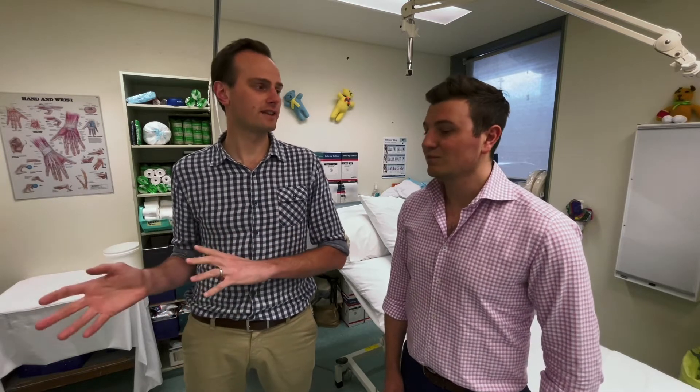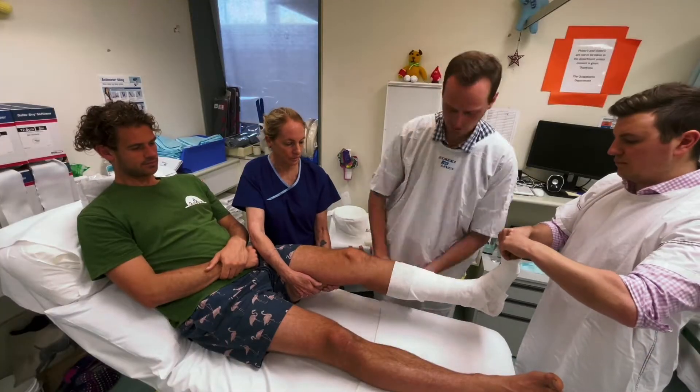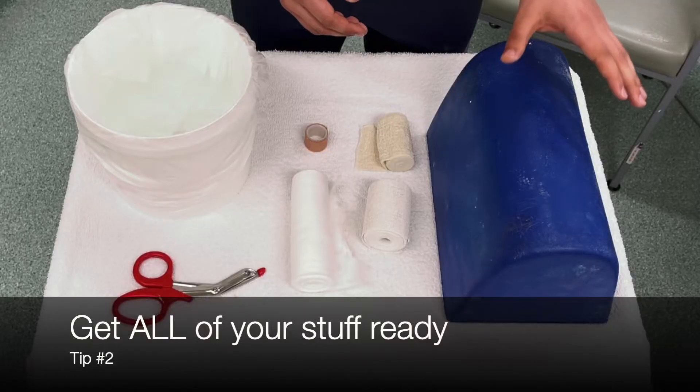We'll start off by talking about the preparation phase, then we'll talk about putting the casts on and the aftercare. In the preparation phase, the first thing to think about is preparing yourself by having enough people around — lots of hands. Find anyone that's around in the emergency department or on the ward to give you a helping hand.